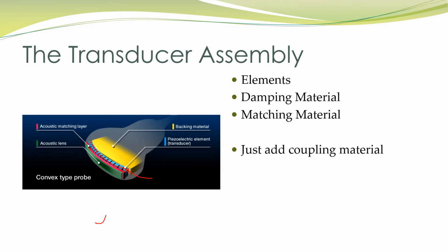I kind of relate this to if we have a bell and we ring that bell, and there's nothing to stop the bell from ringing, it will continue to taper off in its sound production, but it will continue to ring on for a longer period of time than we might intend. The same thing kind of happens with our piezoelectric elements. When that channel provides a voltage and the voltage causes that expansion and contraction of the piezoelectric element, that may not just expand, contract, and stop. It might ring on. And when it rings on, it's producing a pulse that is going to kind of taper on and on. When we have that, it decreases our resolution. So in order to prevent that, they add this backing material that I kind of think about like wrapping a pillow around the bell.